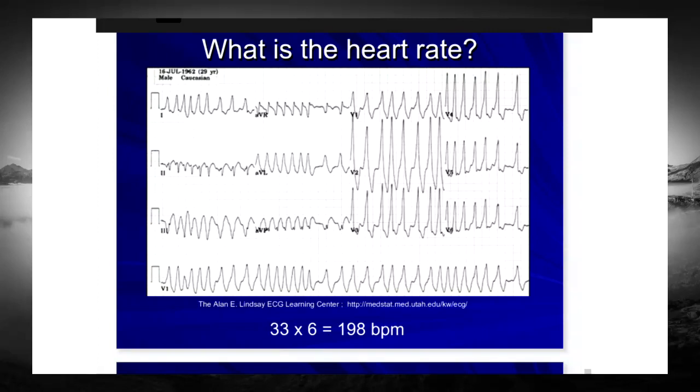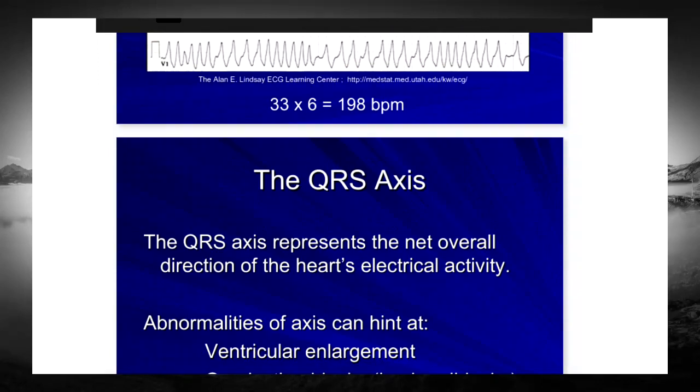This ventricular tachycardia is not one that you can usually use the rule of 300s for. Well, this type, I shouldn't say that. This happened because of long QT, which is a whole other issue. It's going to be what's called torsades de pointes, and it twists around the point, so it's getting faster, slower sometimes. So in this instance you can't do the rule of 300s because you'd have to do it for each set of two, and instead, I just count them all and figure out what it is.